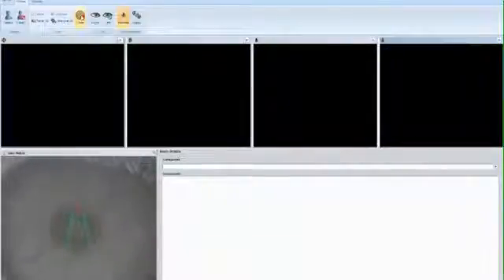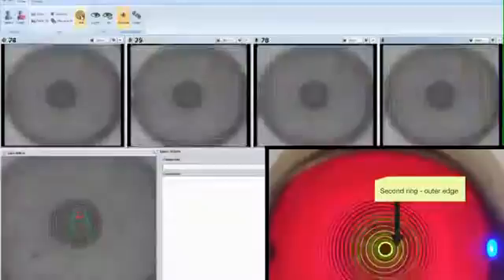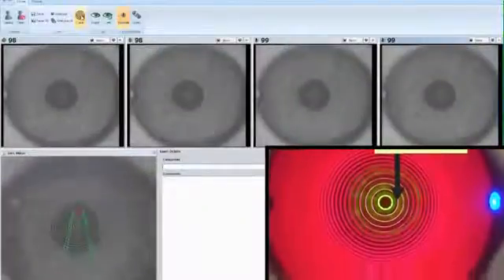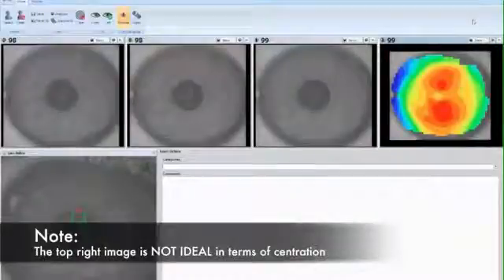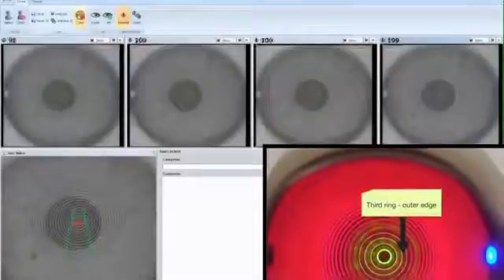We need to ask the patient to look at the outer edge of the second ring. In this example, we are getting close to centration, but we are still not there. Finally, we ask the patient to look horizontally at the outer edge of the third ring toward the nose to achieve a centralised topography.